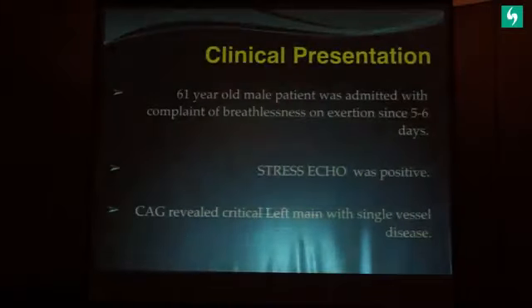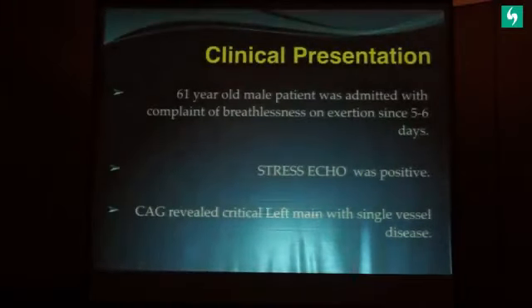This is a 61-year-old gentleman with dyspnea on exertion for 5-6 days. This patient came to us 9 months back. His stress echo was positive, and on the day of admission he had rest angina, so was taken to the hospital, and we underwent an angiogram at about 9:30 at night.